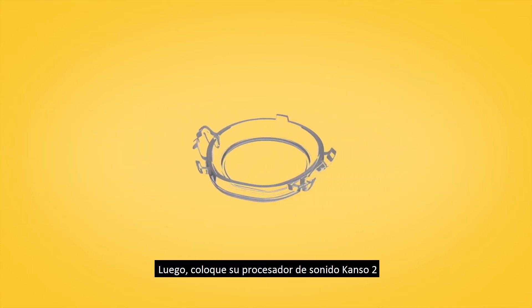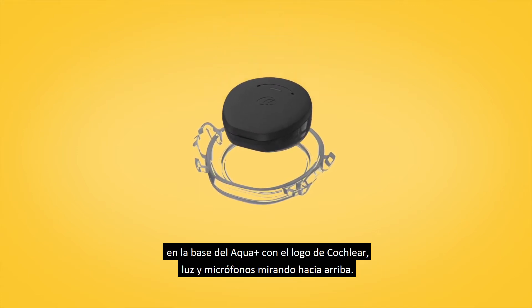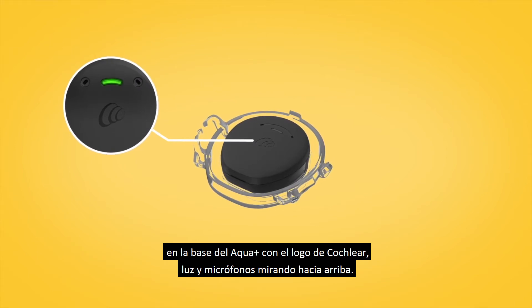Then place your Canso 2 sound processor in the Aqua Plus base with the Cochlear logo, light, and microphones facing up.